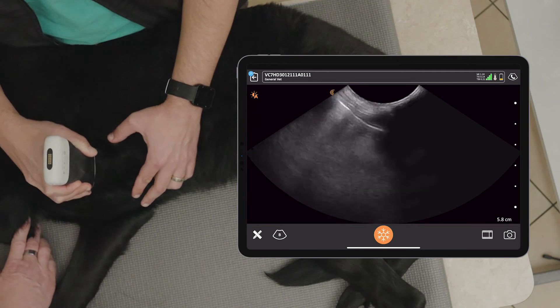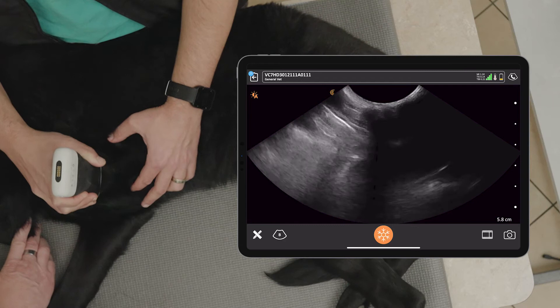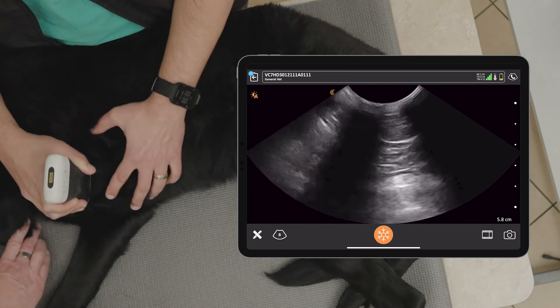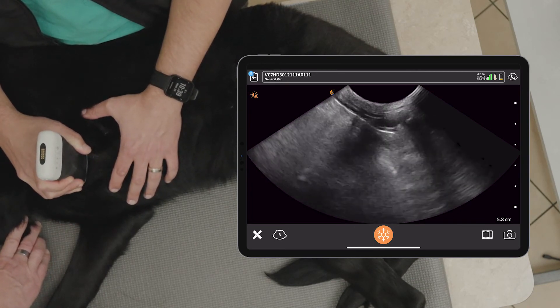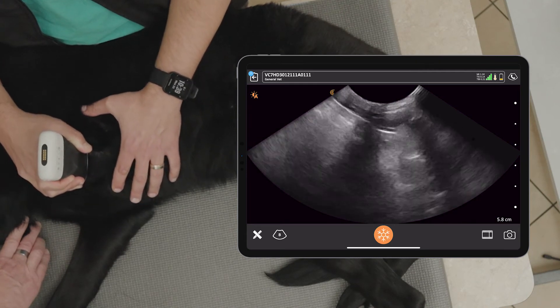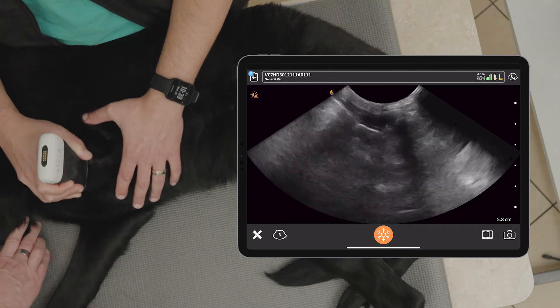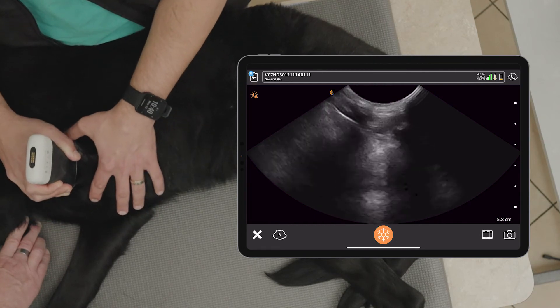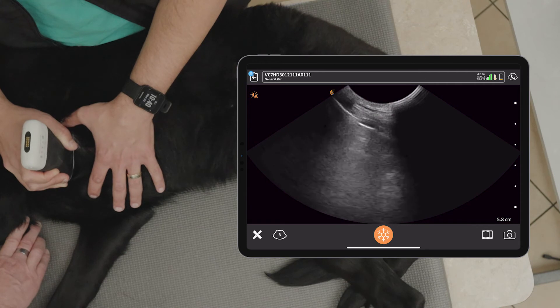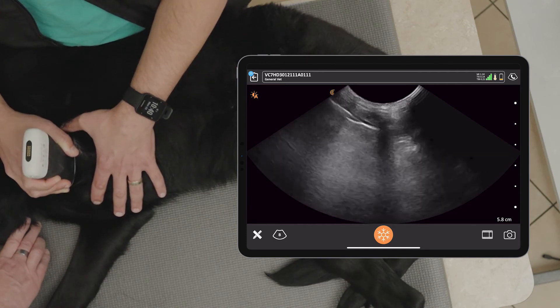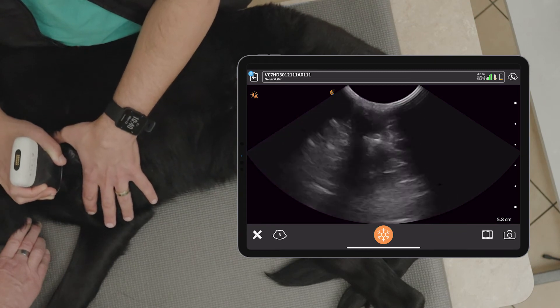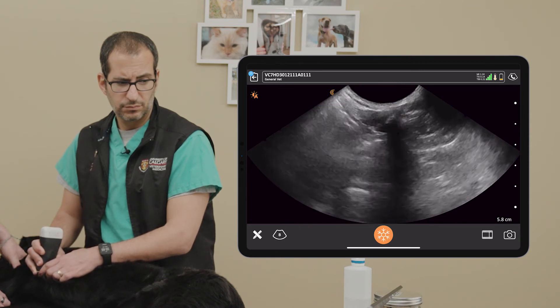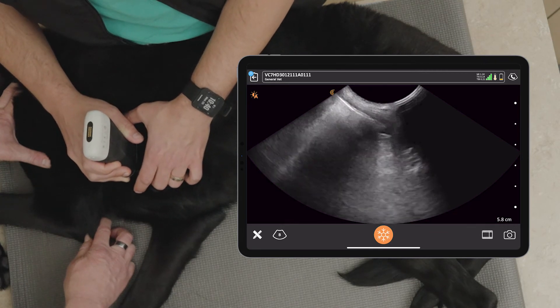We're going to look for pleural effusion all the way along the ventral border, jumping another rib cranial and going up and down between the ribs. We want to explore more area of the ventral lungs — looking for pleural effusion along that sternal border between the lung and the sternal muscles, and looking for lung pathology. Sliding more dorsal with the probe parallel lets us look for actual pathology in the lung itself. We scan up along the lung — no pathology present — and come back down ventral. No pleural effusion. We jump another rib cranial, and now we've got a little bit of the heart visible against the sternal muscles — a little pericardial window — but again, no pleural effusion and no lung pathology.